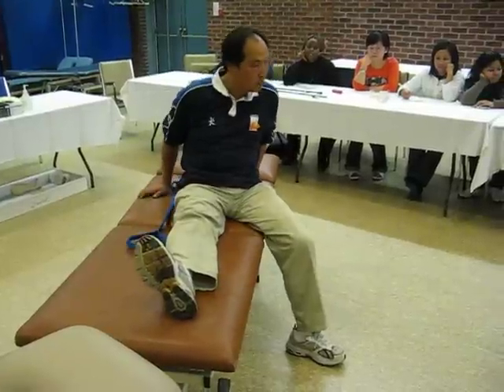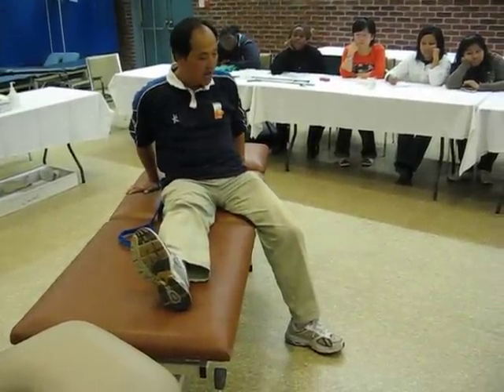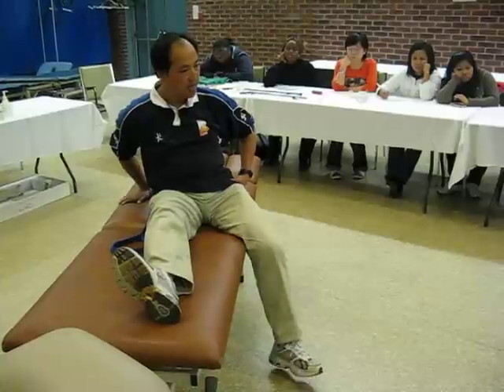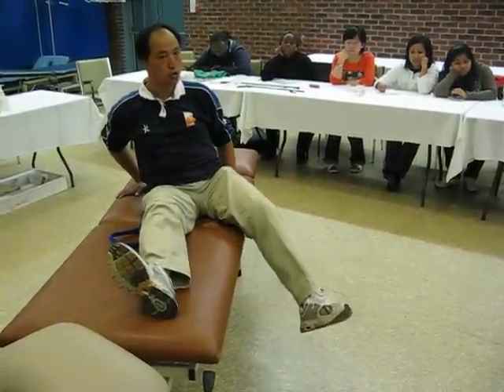Sometimes you can do a few things. First, maybe you can ask the patient to use the body mechanic. If they have weakness to lift it up, you can ask them to see whether they have the power at least to hold. If they can hold — won't drop — but that's not strong enough to lift, you can ask them to hold it there and use the body mechanic. Move the body down and then swing.